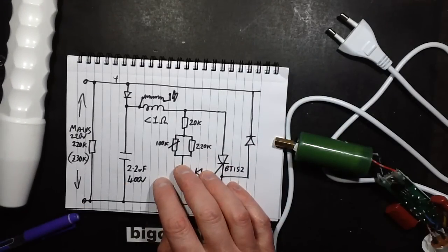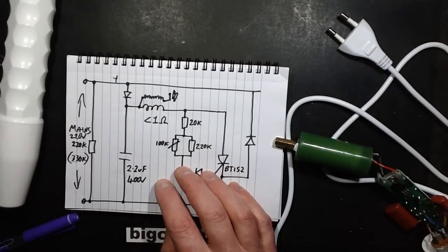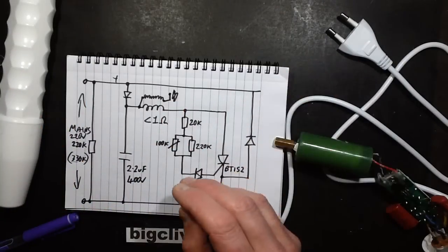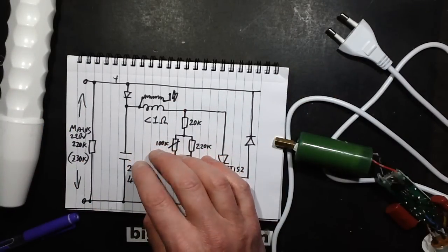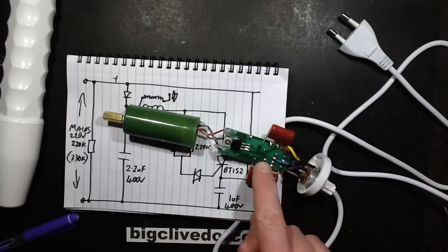I'm going to put it back together now and play with it a bit more, but not near electronic stuff, because it radiates so much of a high voltage gradient that it would potentially damage components in its vicinity. But yes, much simpler than I was expecting, and actually quite neat, quite like that a lot.